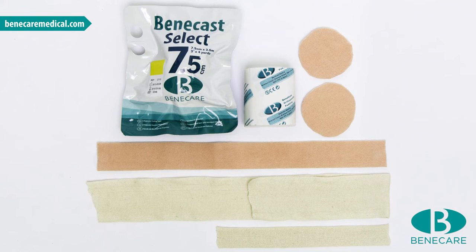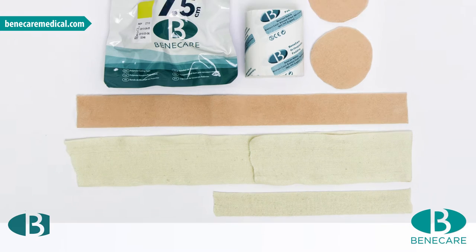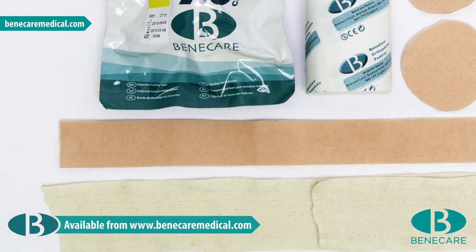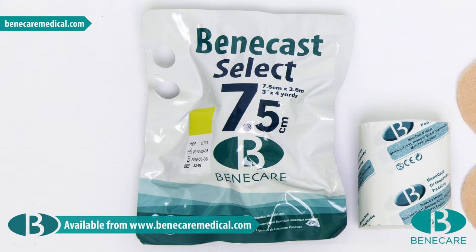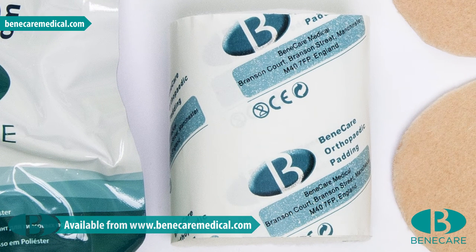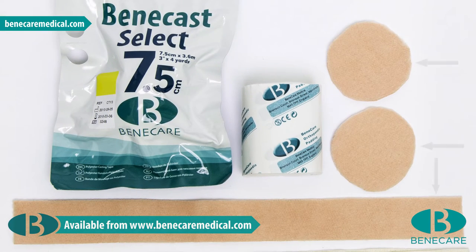Products required for this application include Benecast stockinette, 2.5cm and 5cm, one piece of each. Benecast Select Polyester, 7.5cm, one roll. Benecast synthetic undercast padding, 7.5cm, one roll. Adhesive fleecy web.